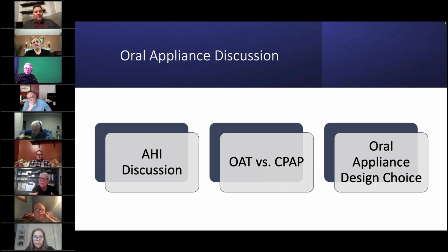Now, all the dorsals are literally saying the same thing. What do they say? Well, we're going to make elastic. And if you want elastic, because we need to keep the mouth closed, then we can add the elastics and you can use that on your dorsal. So literally they're saying the same thing.